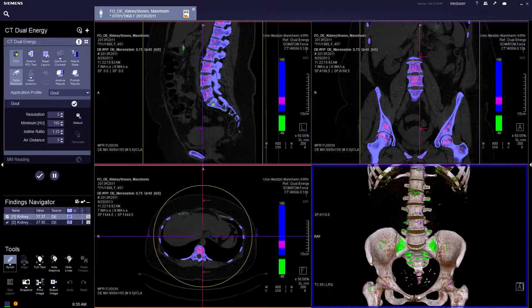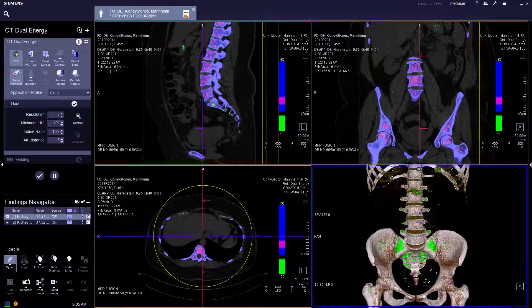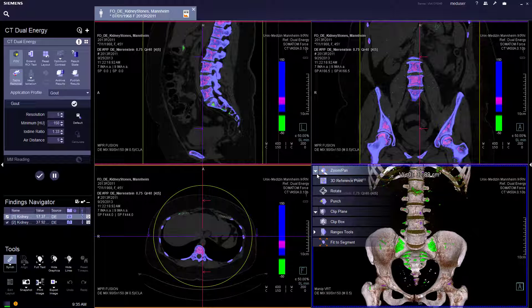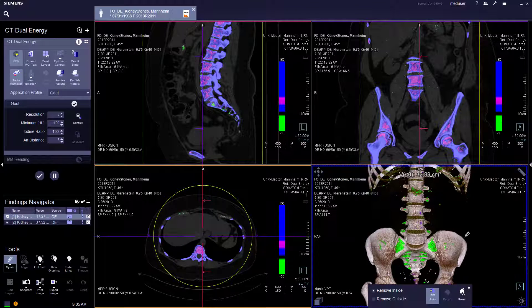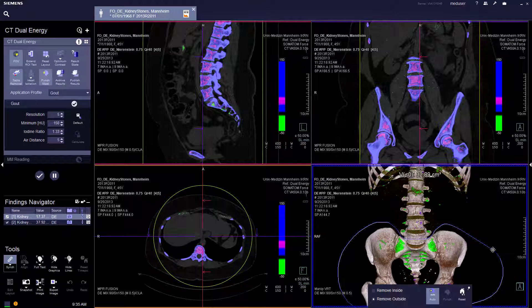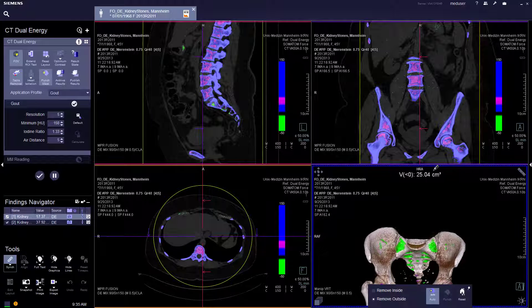You can't mark selectively. If the user only wants to see the volume for a certain region, you can use the punch tool and just highlight that area. The volume will change accordingly to how many crystals are in there.